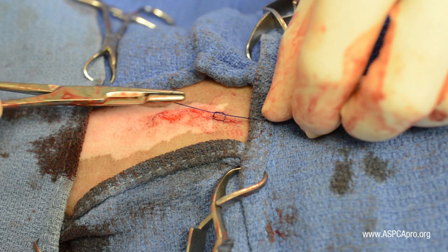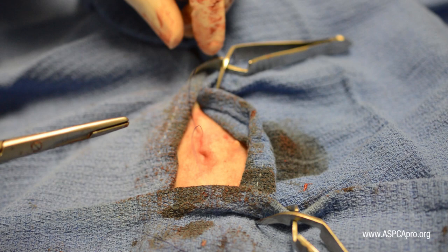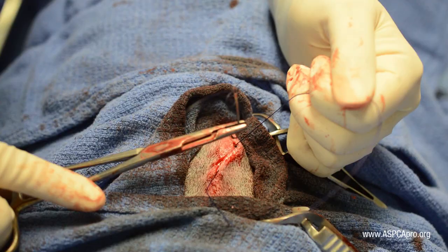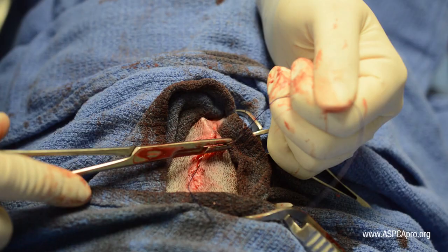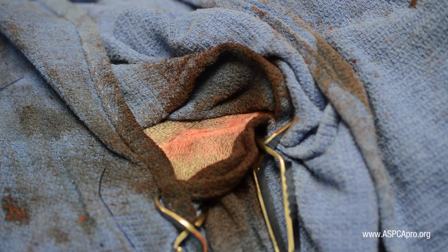Keep suture ends parallel to the incision while tying. If the knot is deep enough, both suture ends may be gently pulled upward and cut at the knot. Alternatively, the free tag can be cut close to the knot and the other end gently pulled upward so the needle can be passed under the knot and out through the skin to facilitate proper burial.